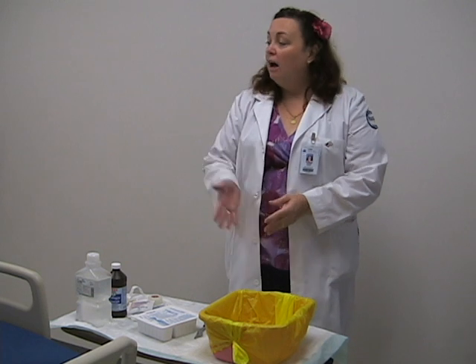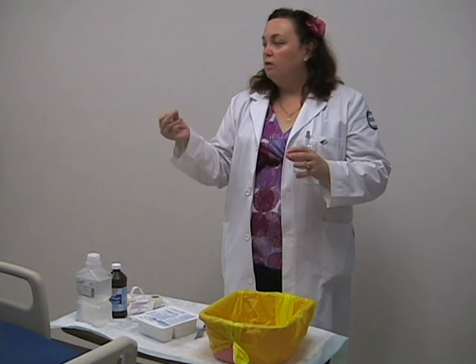So we're going to get started with the tracheostomy care. You want to make sure to do the tracheostomy care after they've been suctioned and that their oxygen levels are okay. Sometimes, with some patients, you may want to give them some extra oxygen with an Ambu bag or some increased flow of oxygen prior to the tracheostomy care.